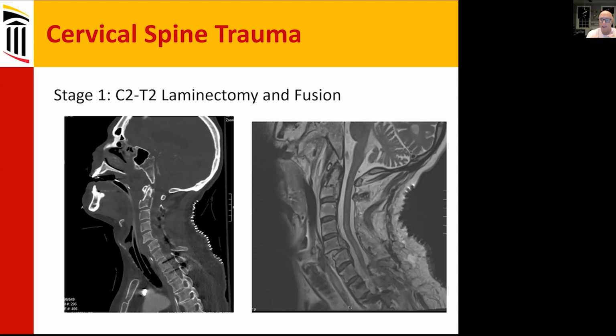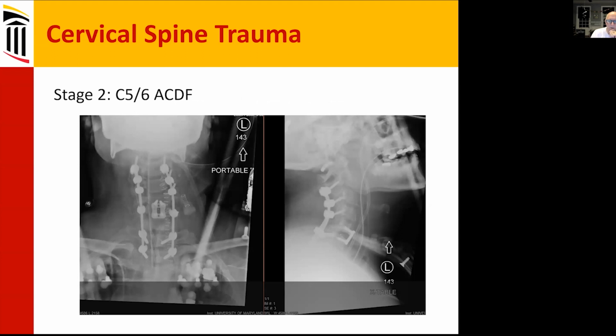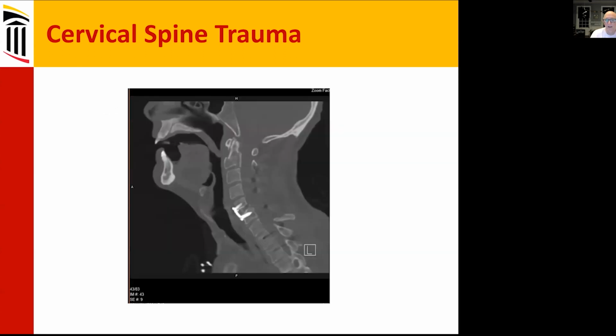So there's stability now. Now it's not optically pleasing, right? So we still see something's amiss. And so there's more work to do. And so had an anterior surgery that shows just a post-op x-ray with the ACDF plate that's in place. And then you can see the alignment is much better through that. And that area can kind of heal with the bone graft that's in there.